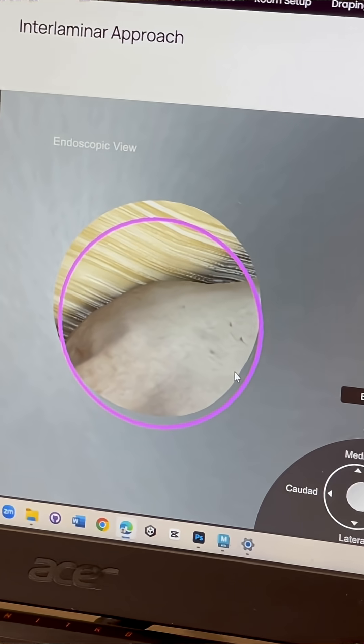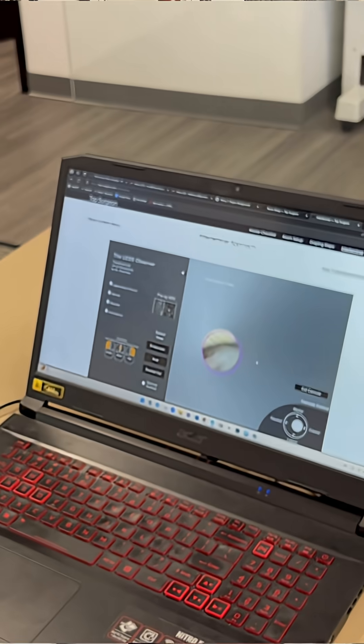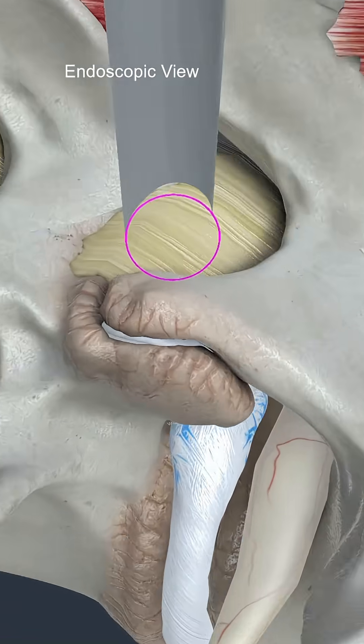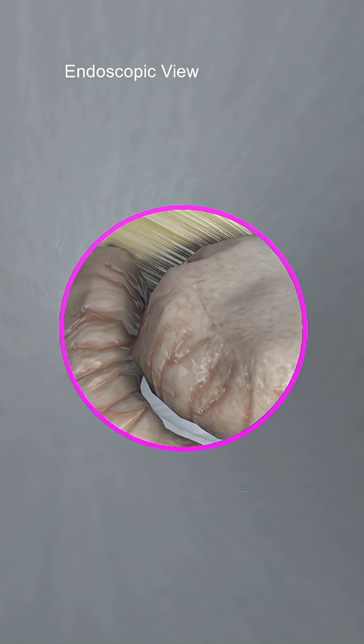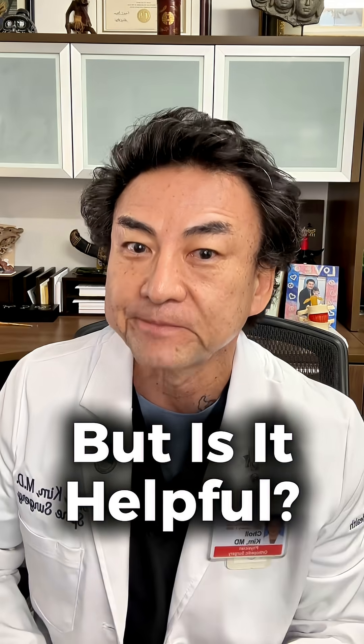Check this out. What if we had an interactive animation that can let the surgeon zoom in and out and look all around? How cool is this? Let me know your thoughts. I already know this is totally cool, but is it helpful for the learning curve? Let me know in the comments.